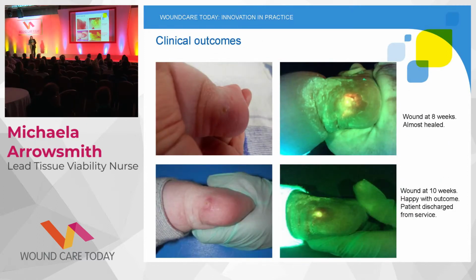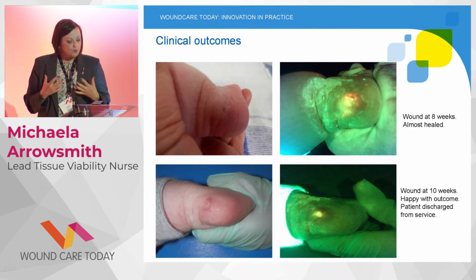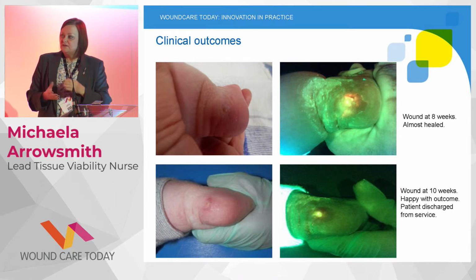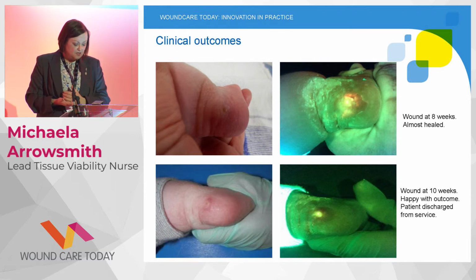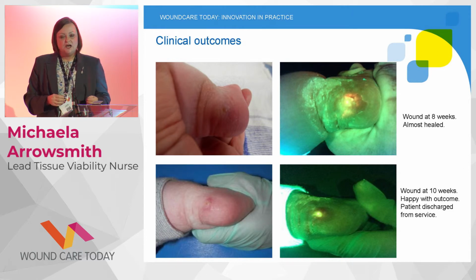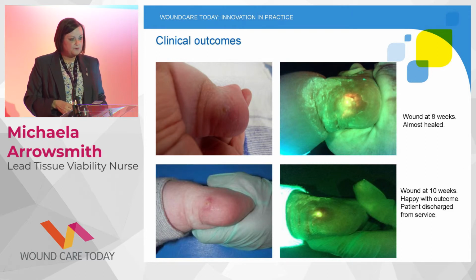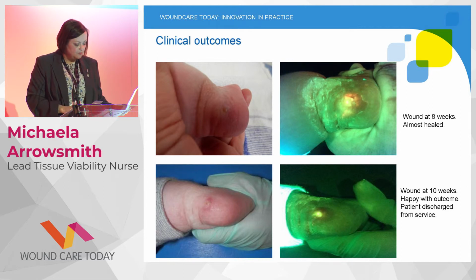Almost healed, surrounding skin still, I think a lot of that is flaky skin, because bearing in mind he's still quite perspiring, and by then he had his boots back on, because we only did a week without them. Then the parents started to increase the time that he's wearing his boots. And after 10 weeks, it's healed, virtually closed over. I haven't seen him again, but I got a Christmas card from the parents. Amazing, after 4 months, but I'll take that.